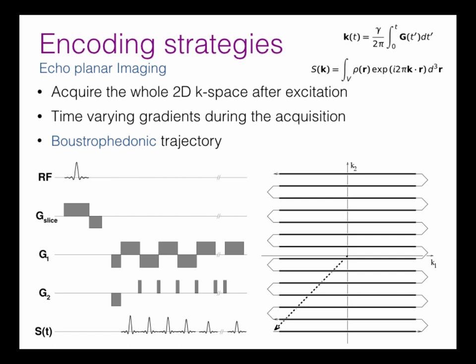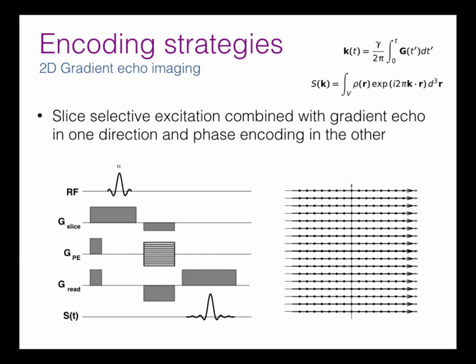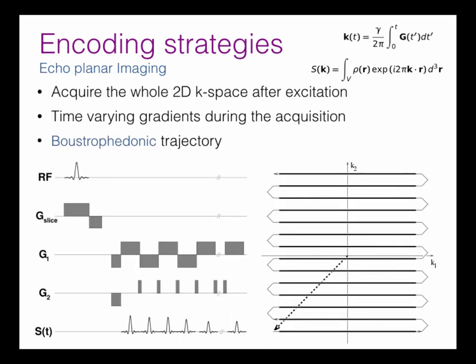A couple of things that are kind of interesting about this is that, compared to the previous one, where all these lines are acquired at the same time relative to the RF pulse, in this acquisition each line is acquired a little bit later in time.